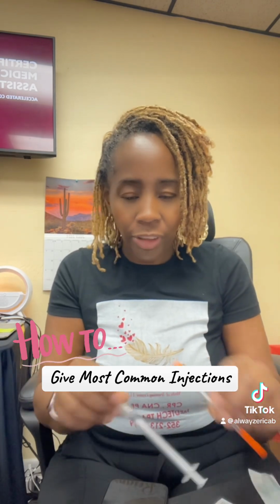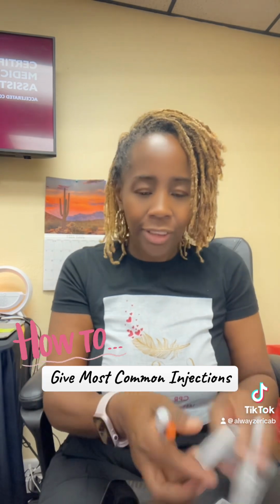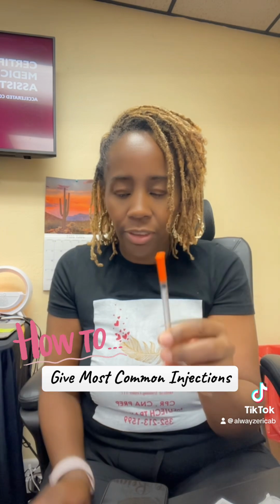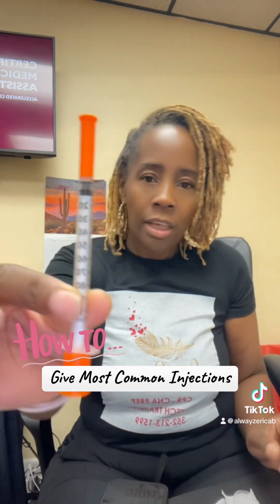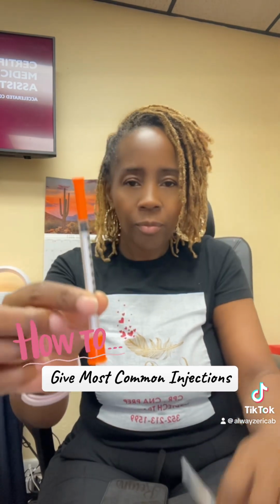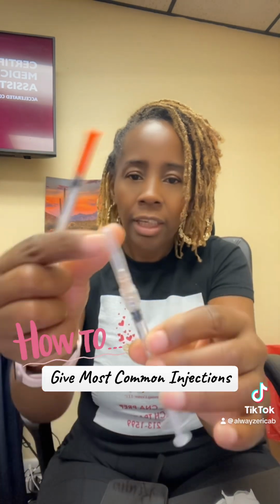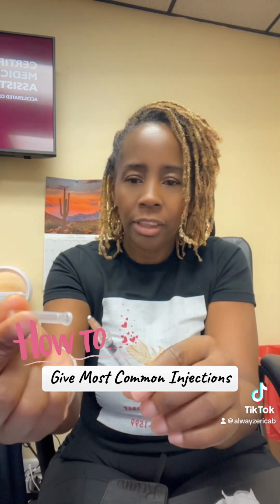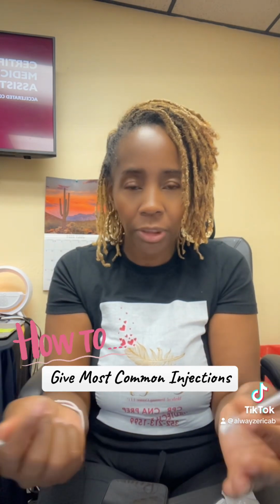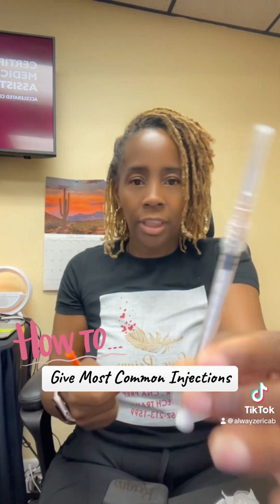Okay, so first things first, I want to talk about the three most common injections. The first one is subcutaneous injection. This is an insulin needle. If you ever see orange, this tells you that this is an insulin needle. Understand that this is an intradermal needle. Intradermal is what you've probably seen if you've ever had a PPD done, which is a TB test for a job placement. If your job ever required you to get a PPD, that is the injection that you would have used.